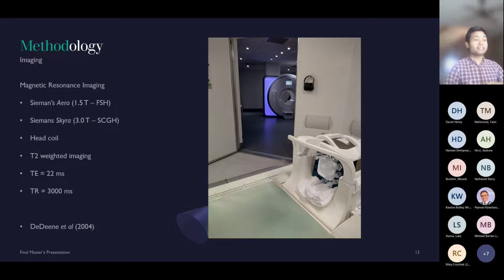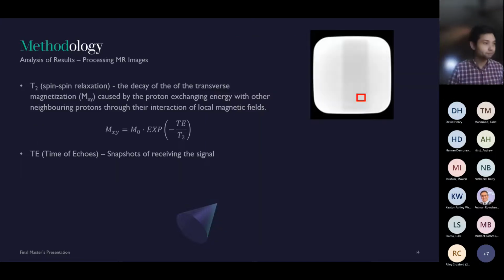You can see in the image that inside the head coil, the calibration syringe is surrounded by the polymer gel, and that blue bit is actually 3D printed. It's so that we can measure the phantom and the calibration syringes at the same time, just to save time, because these MRIs are clinical MRIs, not research MRIs. So there's a lot of time pressure with patients and whatnot.